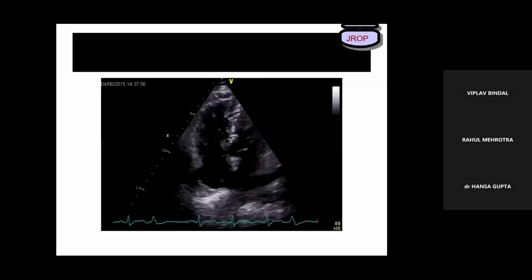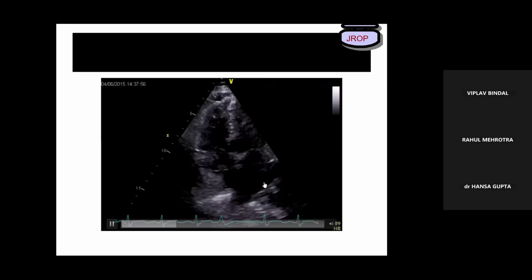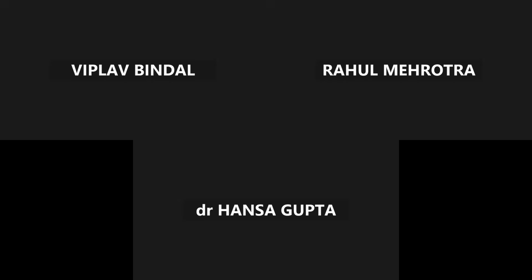So this is one study, and the diagnosis, when correctly stated, was aneurysm along with a flow of bubbles into the left atrium. So let me switch over my slides to another presentation.